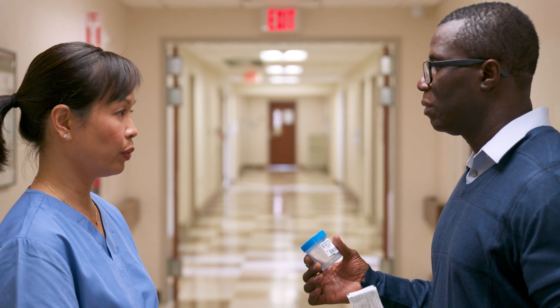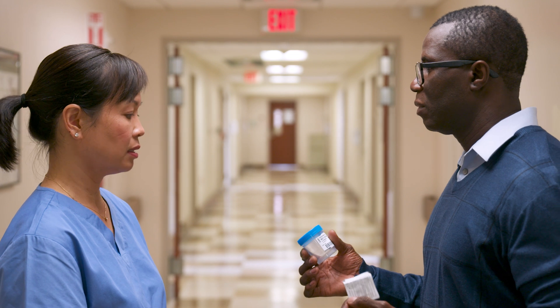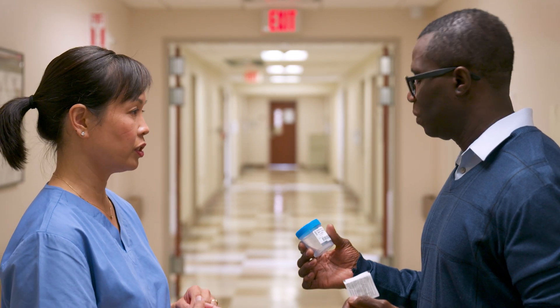Start by urinating into the toilet. After a few seconds, place the open container into the urine stream. Make sure to only touch the outside of the cup.